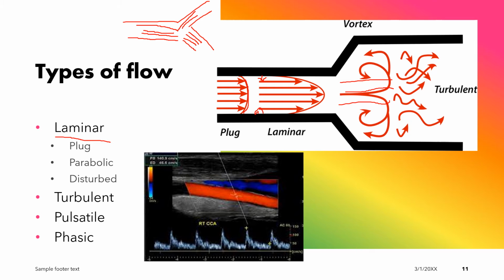Okay, another type of flow is pulsatile, which you're used to listening to, I'm sure, but when we're looking at it on Doppler, with our Doppler sound waves, or with our color Doppler, or with our spectral Doppler, as you see both here, you will see that pulsatility as the flashing of the blood in the artery. Whereas if you're next to a vein, you'll see the vein is much more phasic, meaning it's changing with respiration and thoracic abdominal pressures, but it's not responding in most of our veins to the pulsatility of the heart. So this is a right common carotid artery that we have a waveform here on, and so we definitely appreciate that pulsatility of the arterial system, where we get a systolic peak, early diastole, late diastole, and then a new systolic peak. And we can appreciate the pulsatility as we go through that system.